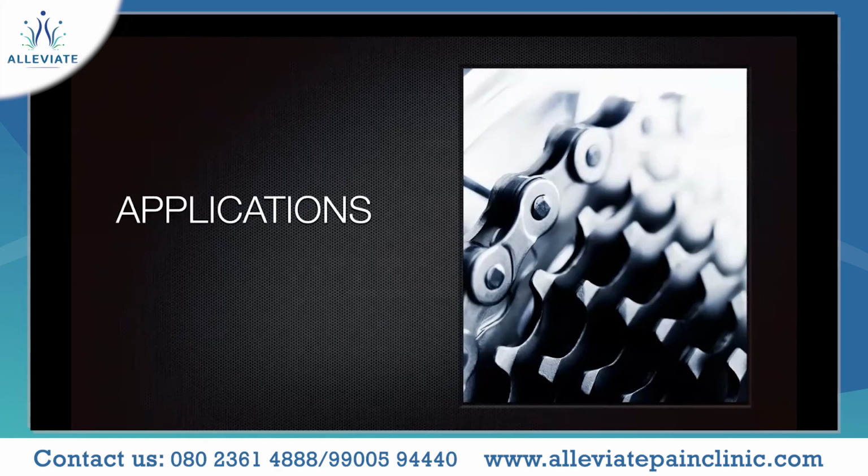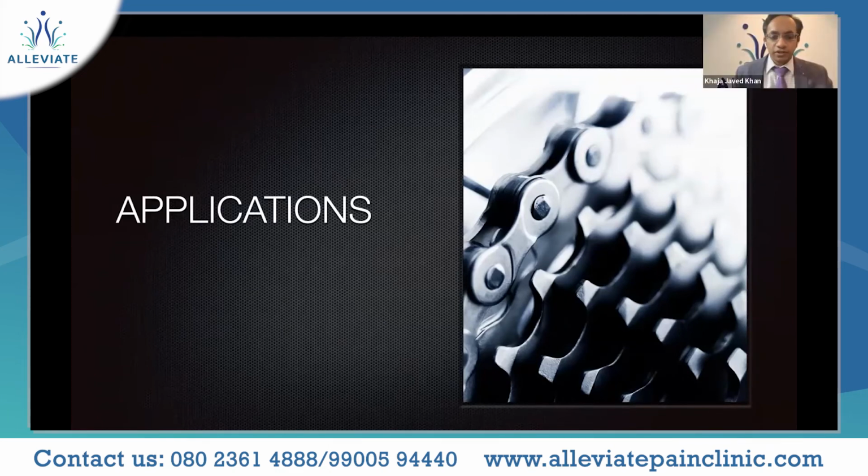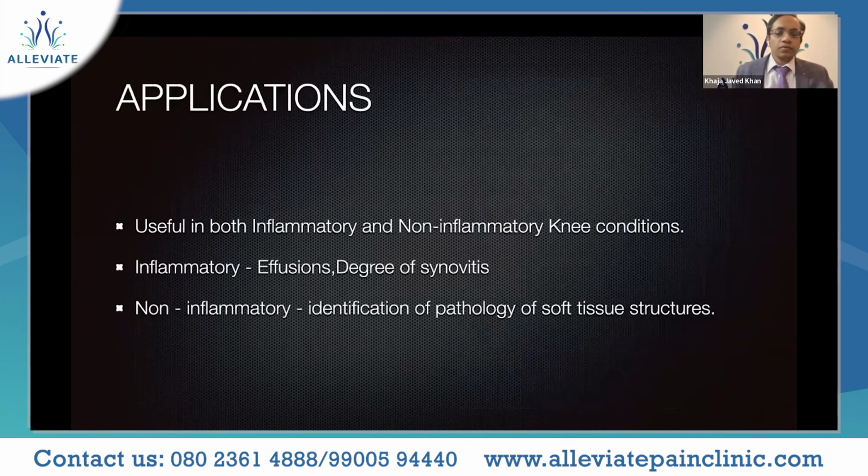Yeah, okay, right. So let's have a look at the applications of the ultrasound now. Remember, ultrasound can be used in both inflammatory and non-inflammatory knee conditions, right? And in inflammatory conditions, what are we looking at? We're looking at effusions and the degree of synovitis. In non-inflammatory conditions, we're looking for identification of pathology of the soft tissue structures.